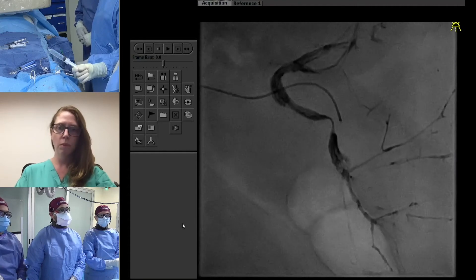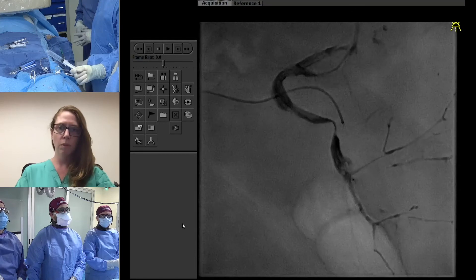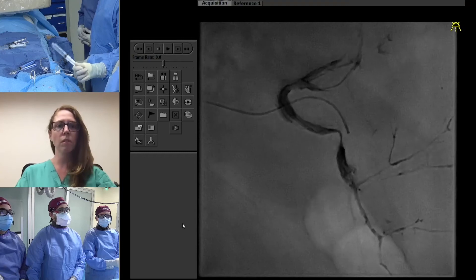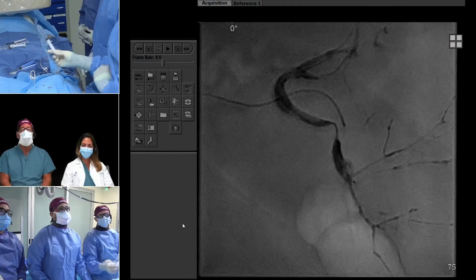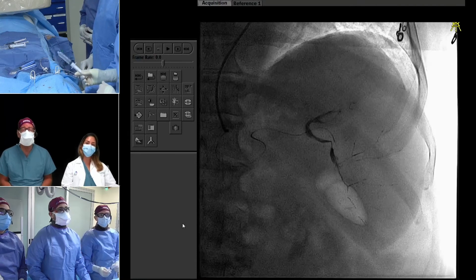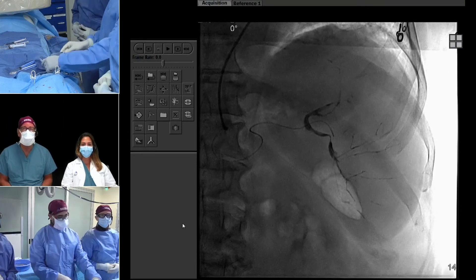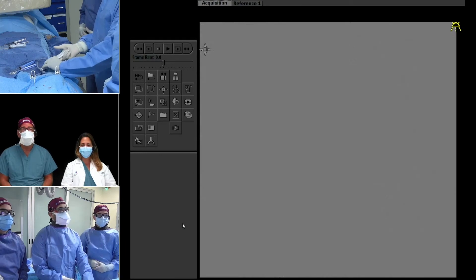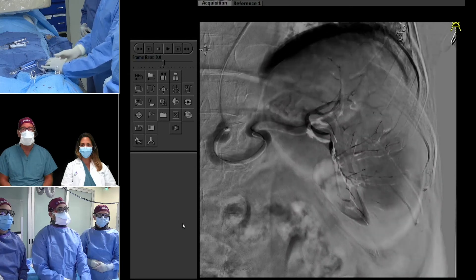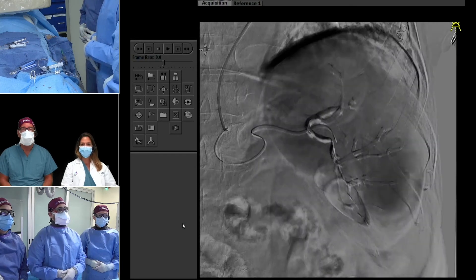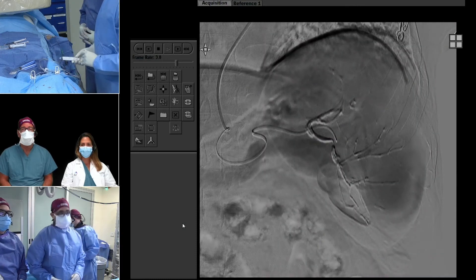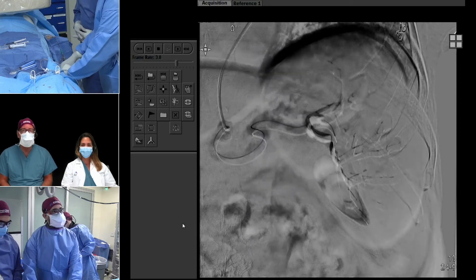This is just the DMSO. I'm hopeful to get away with just one CC of Onyx 18, although I think we're going to need another one. I think you look pretty good, Rahul — honestly, that's a good 25% of the spleen you got there. We may actually not have to go for a second branch. It's a little hard because he's breathing a lot, but that's a decent amount of his spleen right there. I think we may just pack a little bit of Onyx 34 on top.